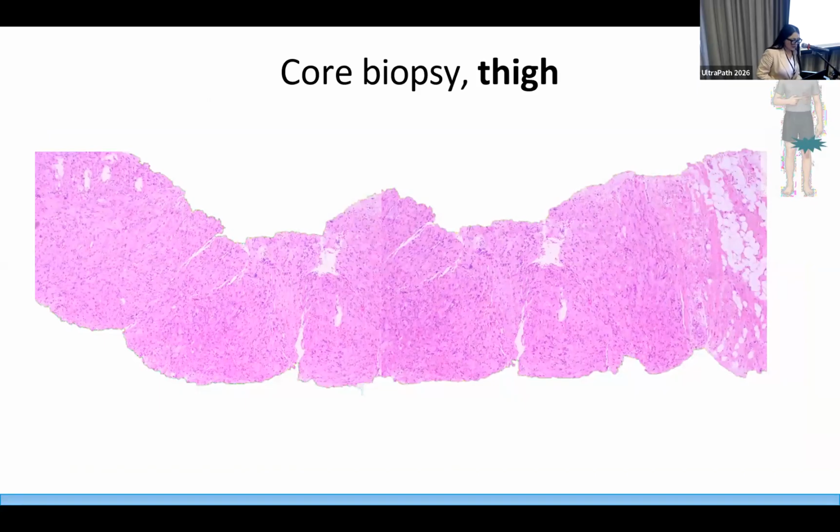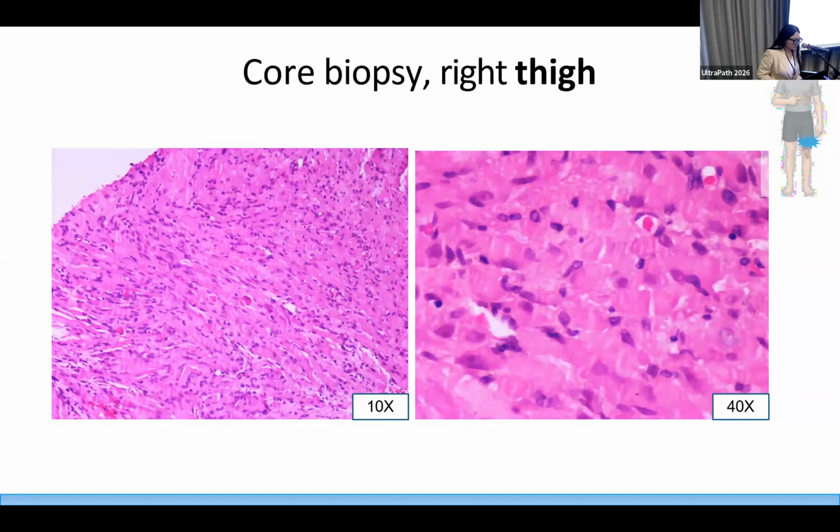this was the core biopsy, and we can observe these infiltrating neoplasms in interlacing fascicles. At higher magnification, the cells are fusocellular, and other cells have this rhabdoid appearance, with the nucleus displaced to the periphery and dense eosinophilic cytoplasm. But we were not able to see any other structure. We do not identify any necrosis or mitosis.